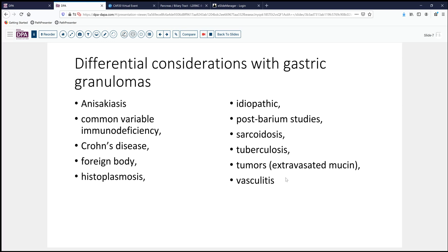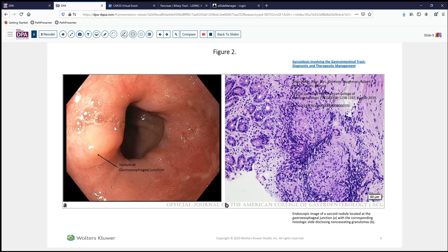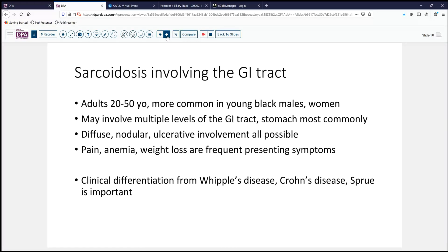Also on the differential are sarcoidosis, tuberculosis, vasculitis, and neoplasia if granulomas contain mucin. For a generalized picture, we'd consider common variable immunodeficiency, Crohn's disease, sarcoid, and tuberculosis. Vasculitis is less likely as we didn't see supporting changes. Further workup disclosed gastric ulcerations, and a nodule at the GE junction — characteristic tight granulomas as seen especially in early sarcoidosis. Our patient does have sarcoidosis, confirmed by elevated calcium and elevated angiotensin-converting enzyme levels.